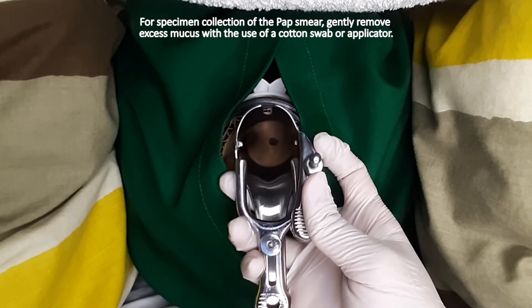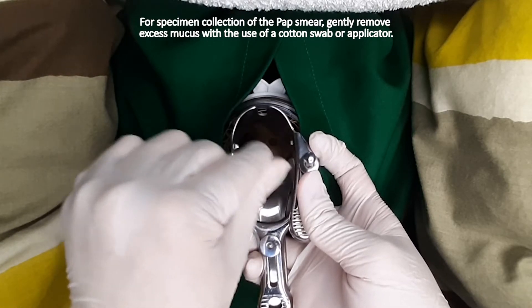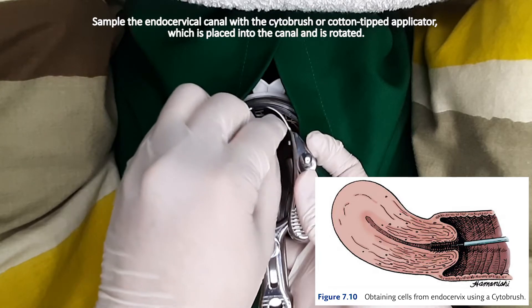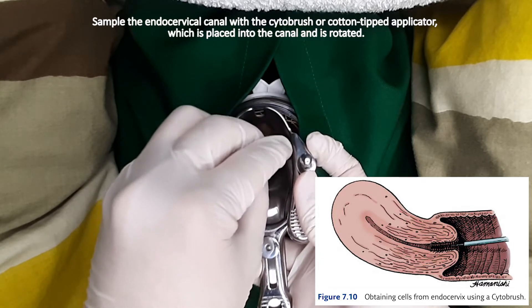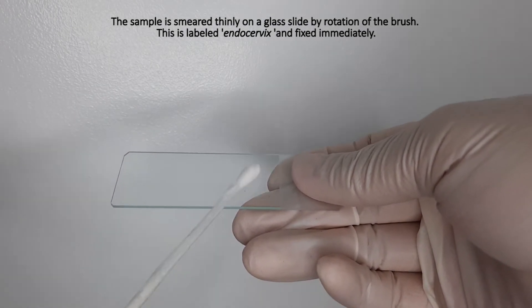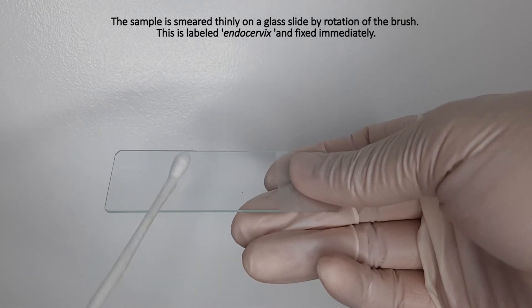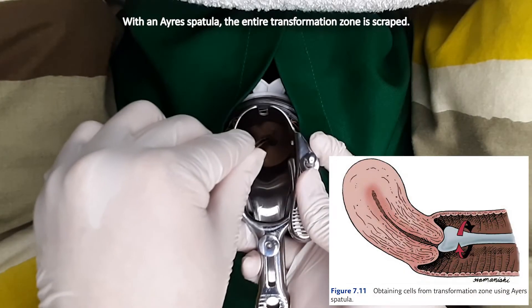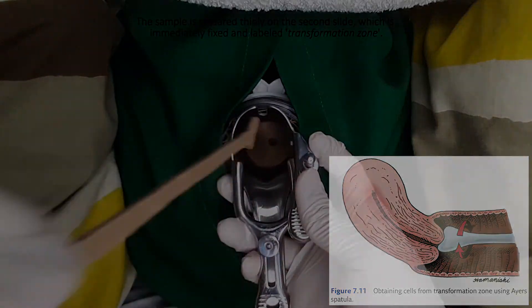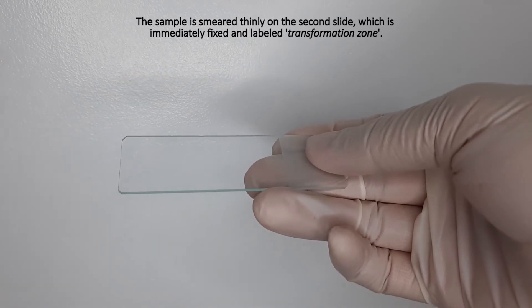For specimen collection of the pap smear, gently remove excess mucus with the use of a cotton swab or applicator. Sample the endocervical canal with the cytobrush or cotton-tipped applicator, which is placed into the canal and rotated. The sample is smeared thinly on a glass slide by rotation of the brush. This is labeled endocervix and fixed immediately. With an Ayre's spatula, the entire transformation zone is scraped. The sample is smeared thinly on the second slide, which is immediately fixed and labeled transformation zone.